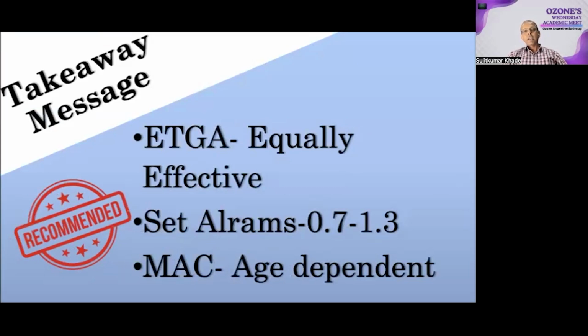During end-tidal anesthesia gas monitoring, always set the audible alarm to indicate when the gas concentration falls below 0.7 MAC or it exceeds 1.3 MAC. This will reduce the risk of intraoperative awareness. Remember that MAC is age dependent, and unless you enter the correct age of the patient on the monitor, it will not calculate the correct MAC for your patients. If you compare the cost between BIS and end-tidal anesthesia gas monitor, the overall cost to the patient will be less with the end-tidal anesthesia gas monitor.